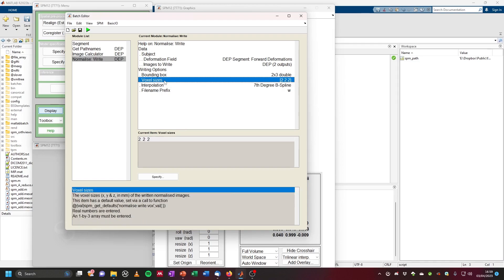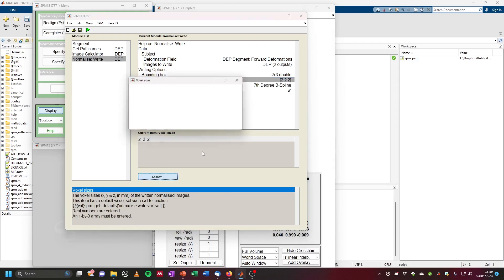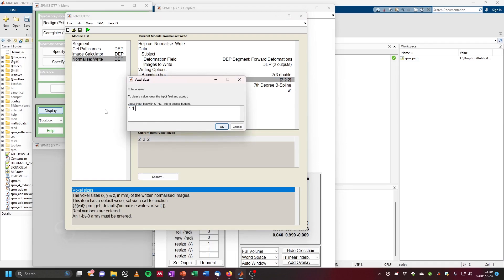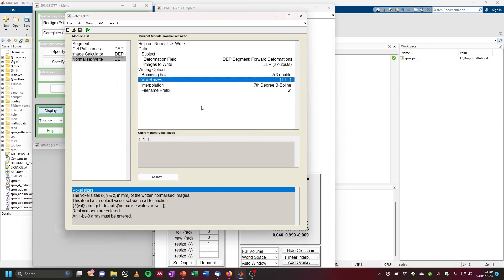For voxel sizes, I like to use one by one by one, which is the resolution of our structural image. That's it — you can simply press run, the green arrow, and it will perform all of these steps for you.